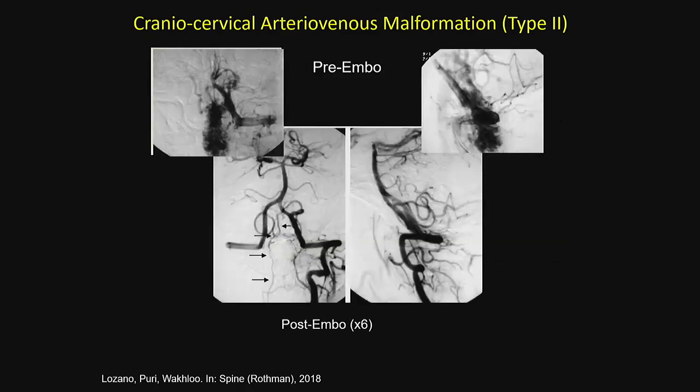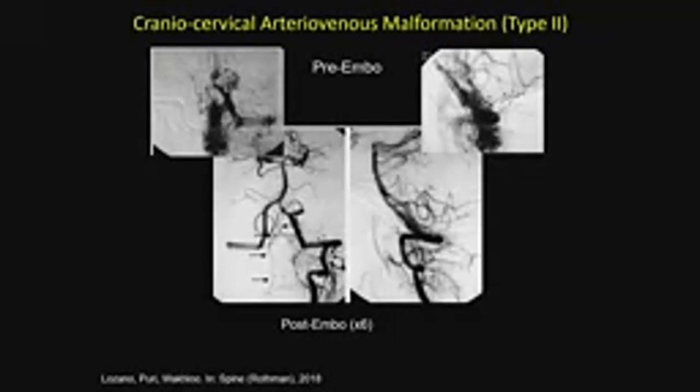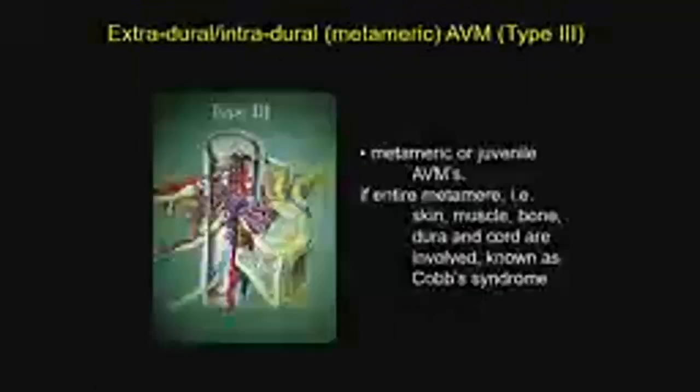This is the final result. Down in your frontal view, you see the anterior spinal artery on both sides with complete devascularization. You can do that, but it takes, like I said, a lot of work, a lot of patience. It's not a one shot and that's done.